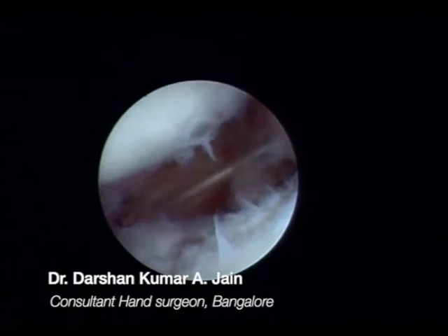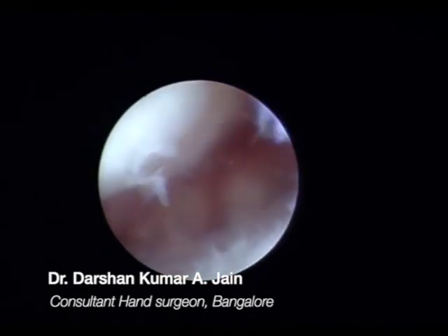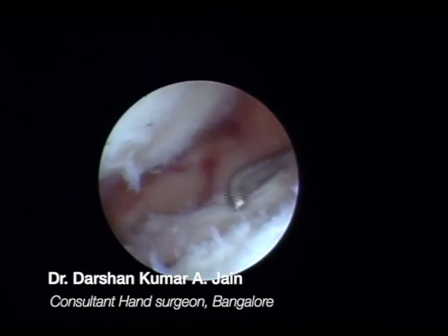These are the fracture fragments and the fracture line in both the sagittal and coronal plane, in the scaphoid fossa as well as the lunate fossa of the distal radius. I'm trying to lift the fragment through the 3-4 portal using a probe. Once you elevate that fragment, you check through the C-arm and ensure the fragment is stabilized.